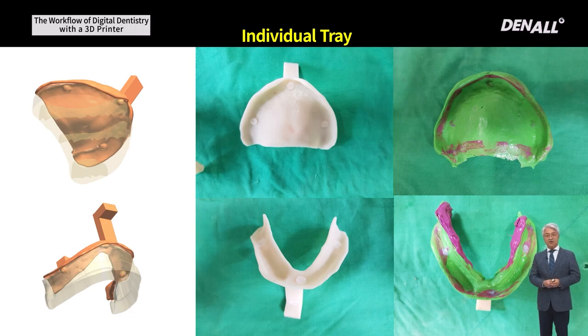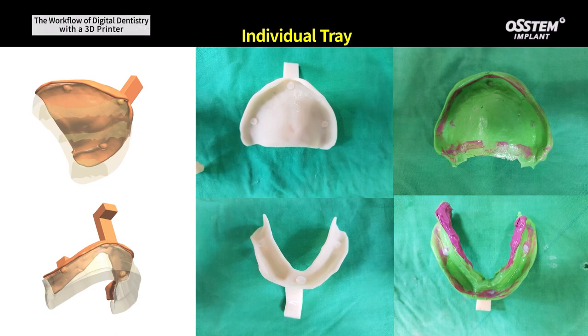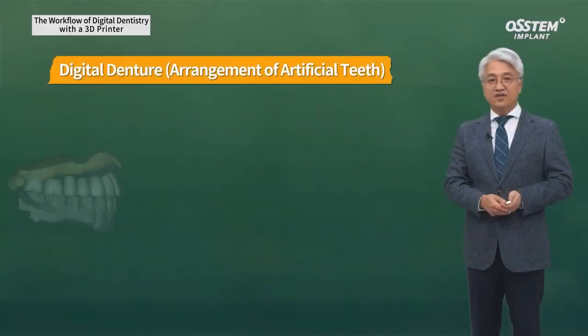After the onset of 3D printer, such manual work that was done at the dental clinic and the lab is largely eliminated, and the time spent doing such manual work is now replaced with other clinical activities. After designing, we print it out using 3D printer. Therefore, in terms of time and human resources, we are saving a lot.